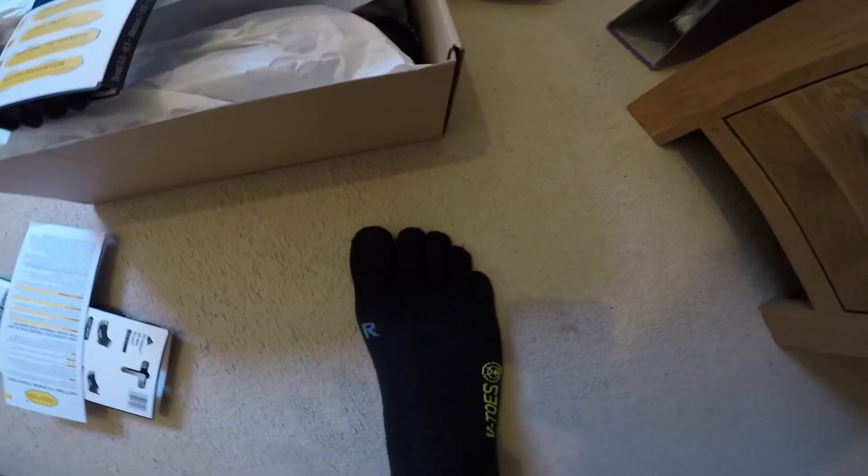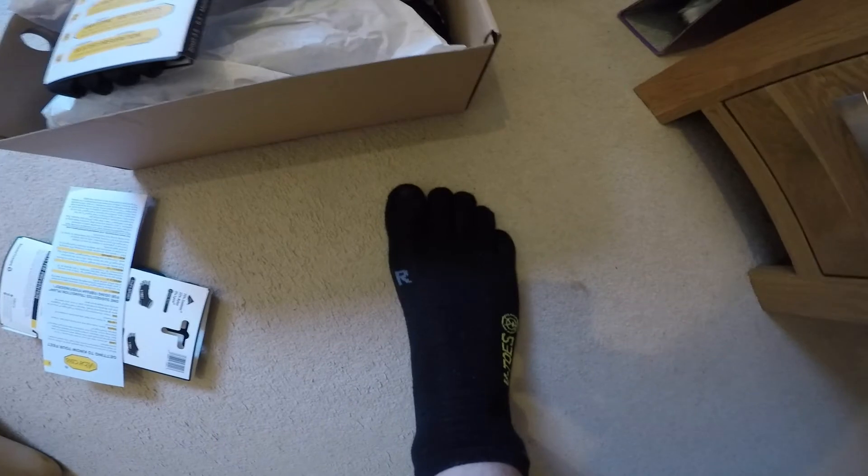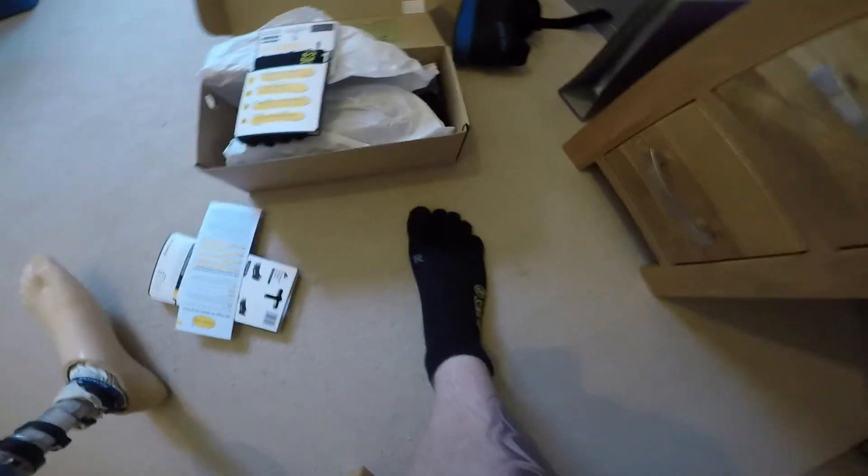I put them on and instantly it felt slightly weird having the material in between the toes - just a sensation that you don't normally feel. However, within minutes that had gone; they now just feel really comfortable and warm as well. I've got the five-finger socks on.